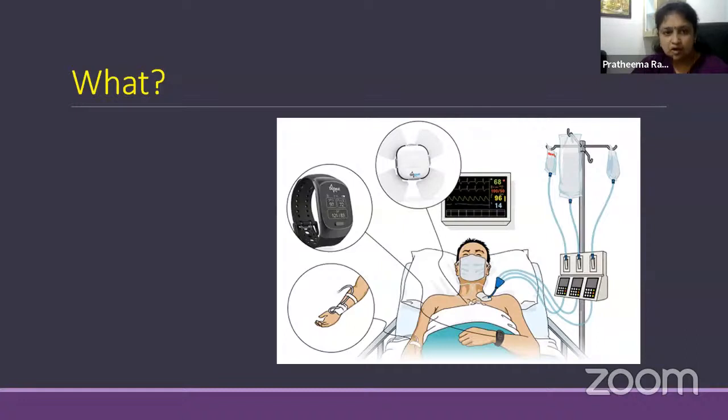As Dr. Aarthi comprehensively talked about all the methods of hemodynamic monitoring, basically we use all these monitors only to see whether the blood is getting appropriately perfused and the tissues are getting proper oxygen, and vice versa. Are the tissues clearing off the toxic materials, is it coming back to the heart, going to the lungs, and is the blood getting purified? This is what we need to know in a patient.